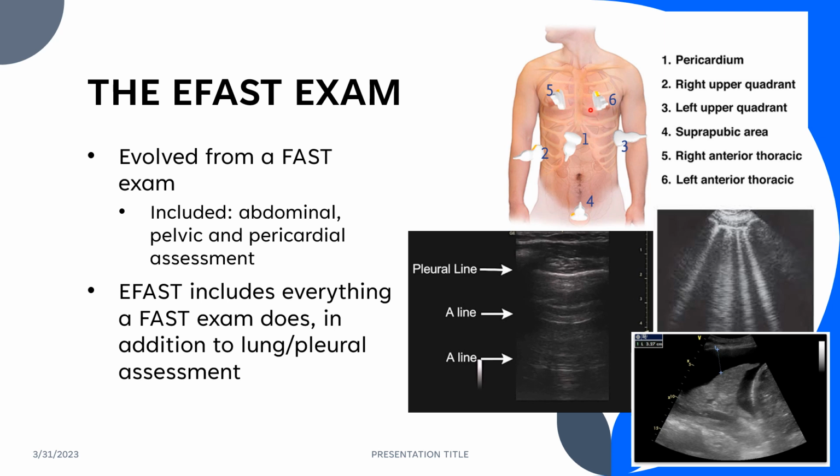And now this is a common area to detect pericardial effusions or hemopericardium, and so this can be a very useful evaluation to see if that patient has tamponade or possibly some fluid collecting there in that pericardial region. From there, and now the order that you're doing this in is going to depend a little bit on the patient condition, what their trauma was, and what you're hoping to accomplish. So just realize that the order by which you would do all of these images can be varied depending on what your concern at the moment is.